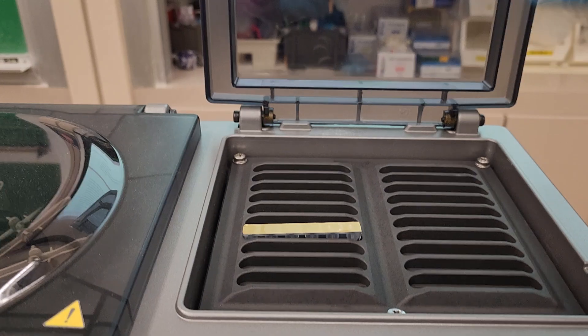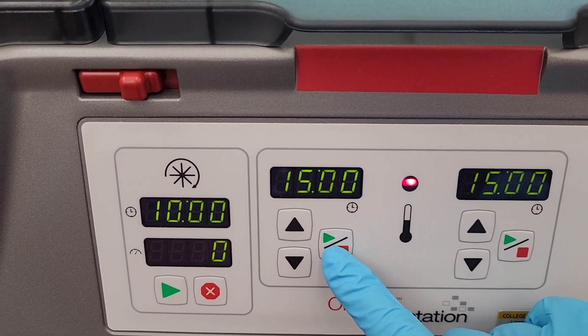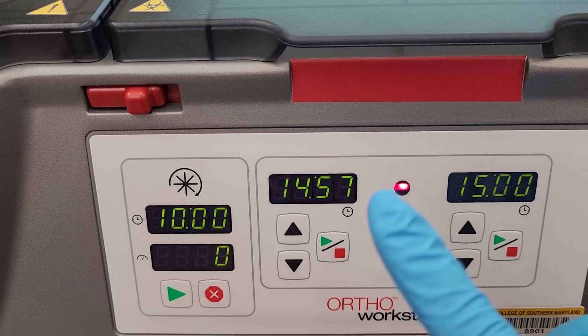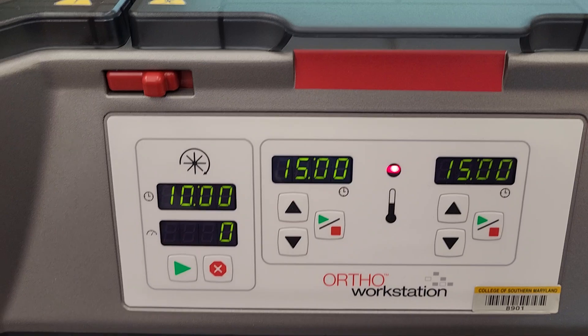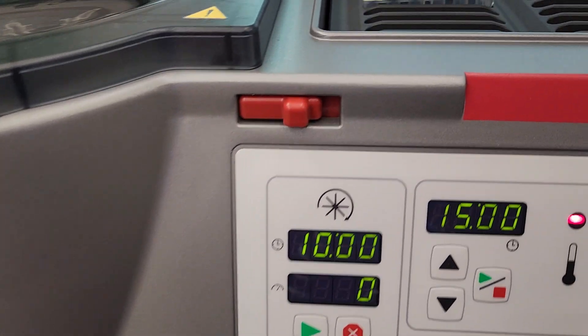What would happen there is you would close the lid so that the heat stays in, and you would press the go button and it'll start to count down. If you don't press that go button, it's not going to count down and it's going to be in there forever — and you're not going to remember how long it's been in.